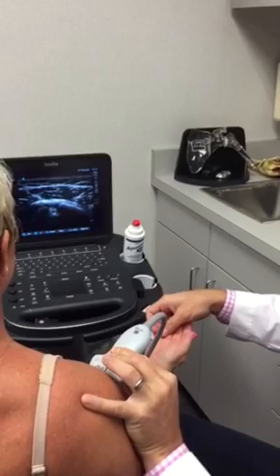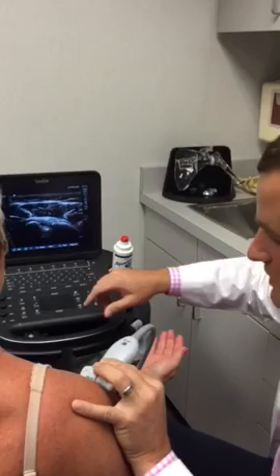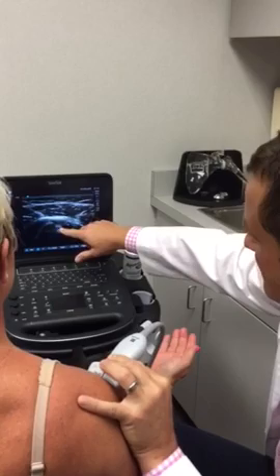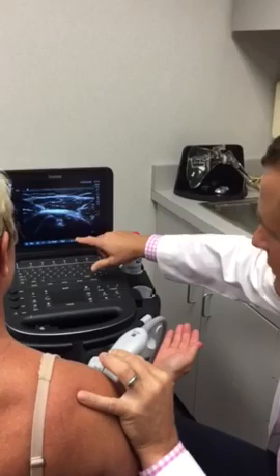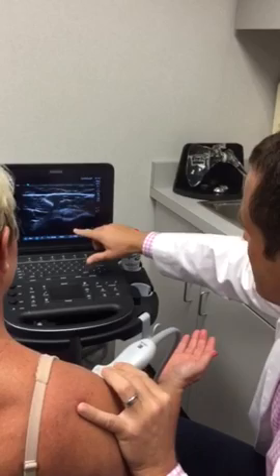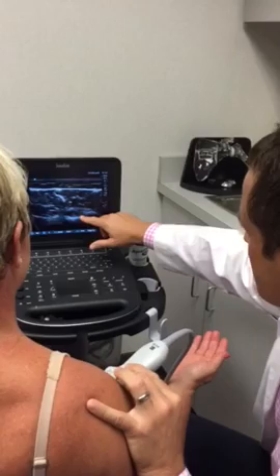Talking about anisotropy: the tendon is white right now, but if I toggle the probe up or down, the ultrasound waves aren't hitting the tendon perpendicular, so it becomes hypoechoic — that's a false negative. You have to play with the toggling of the probe to get that tendon white to make sure you're in the right plane.